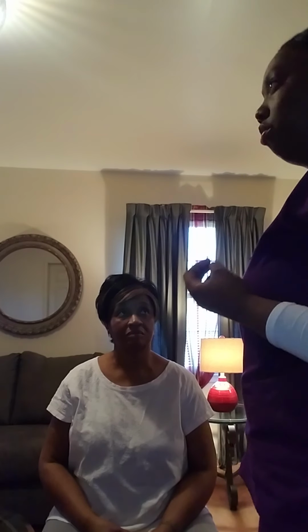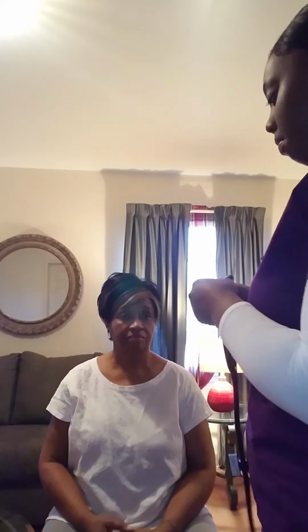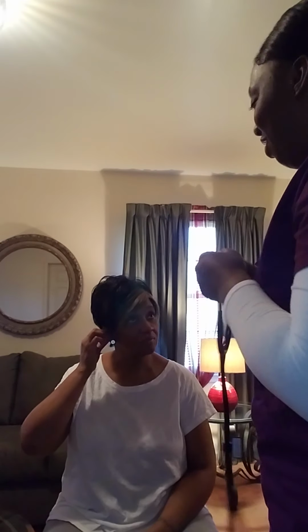As I percussed your lungs, I was looking for what's called resonance sounds, which are low-pitched, hollow, drum-like sounds, which we heard in all fields, which is good. Now one of the last things I'm going to do with your lung region is auscultate, or listen to your lungs. I'm going to use the diaphragm of my stethoscope as I do this.